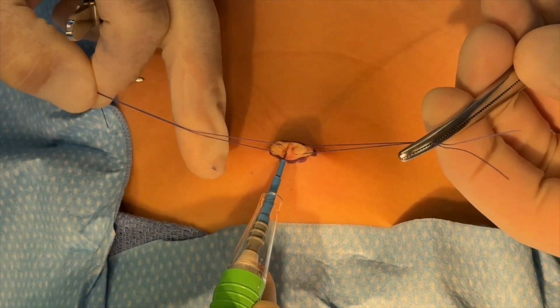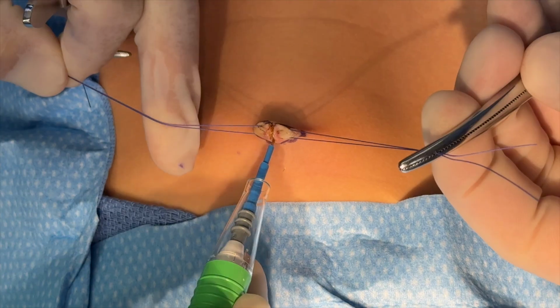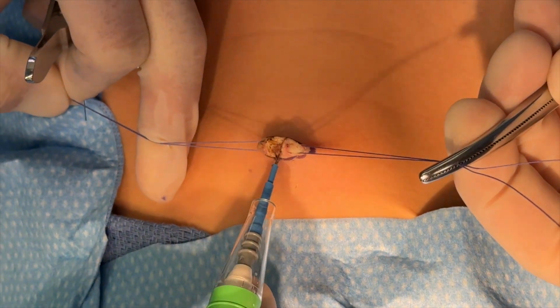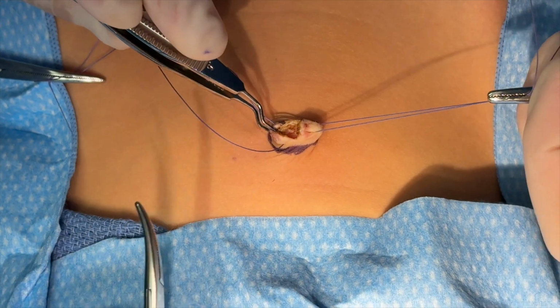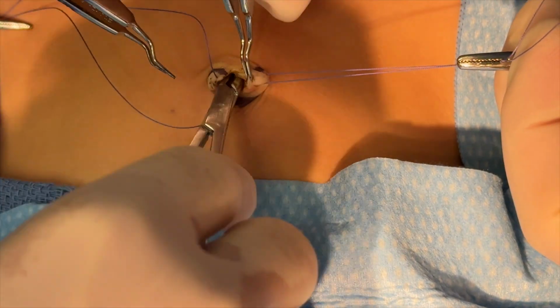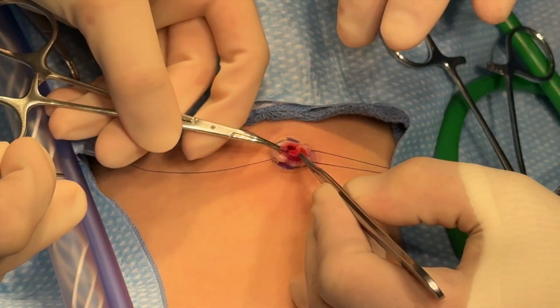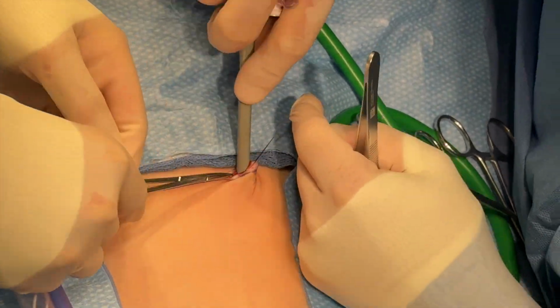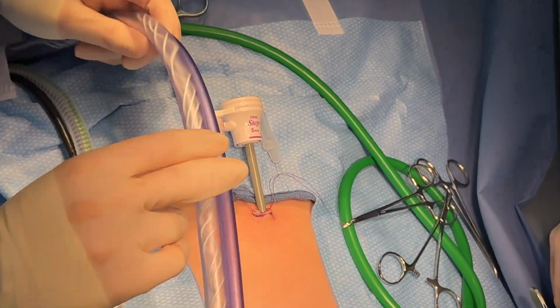Dissection is carried through the subcutaneous tissue using electrocautery until the umbilical scar and rectus sheath are visualized. The rectus sheath and peritoneum are incised. Forceps is used to provide additional countertraction, and the peritoneum is bluntly entered using a hemostat angled at the anterior abdominal wall. Once the surgeon feels that they have entered an open cavity and the abdominal viscera are visualized, a trocar with blunt inner cannula can be advanced into the peritoneal cavity. This is followed by a water drop test to confirm entry into an open cavity and insufflation.